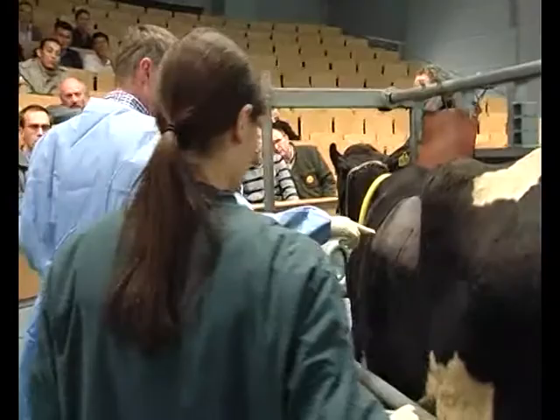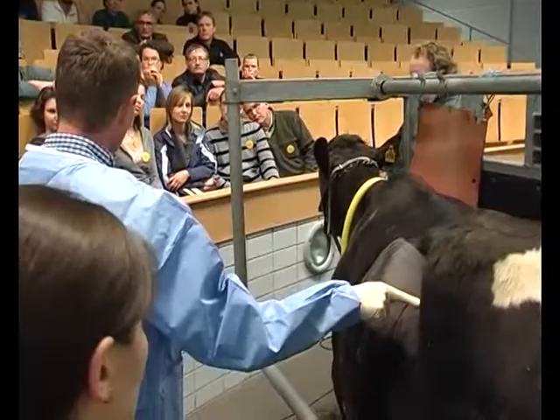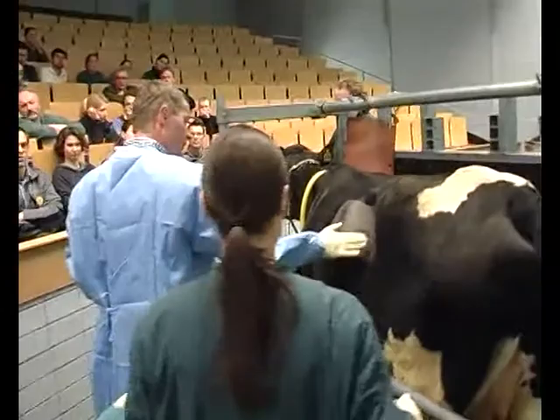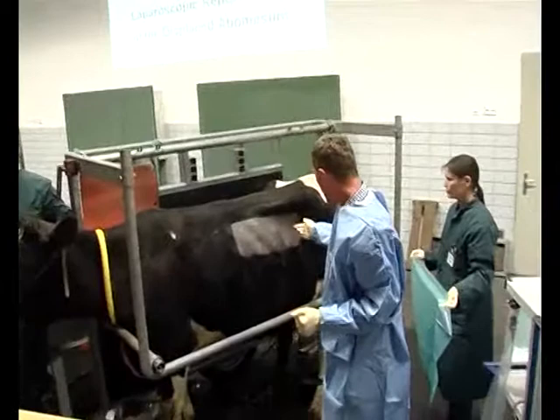The extra rib you can feel here, you go a little bit more behind the rib. And in case during your learning curve you are not sure to get into the abdomen, we clean this area, make a local anesthetic here, and make a dorsal caudal position of your first trocar, because the rumen is here and you never will puncture the abomasum or any other organ. And then you go in here. But as you can see, the rumen is turning over and over, and you wait for the rumen turning. This is a very highly displaced abomasum.